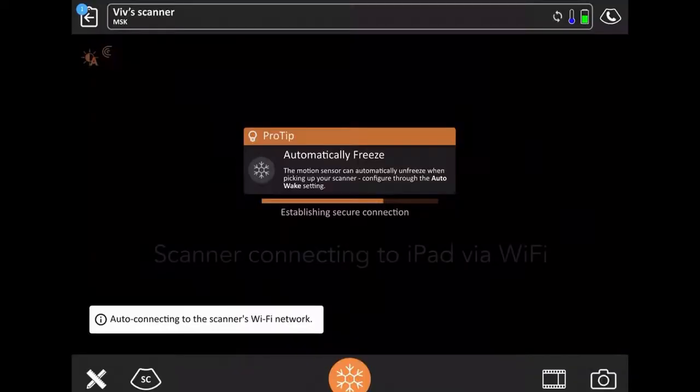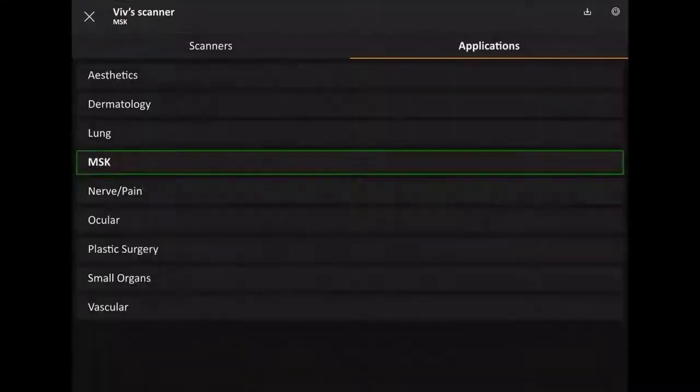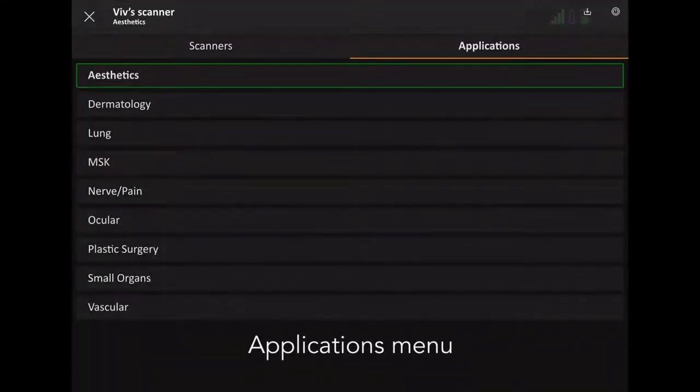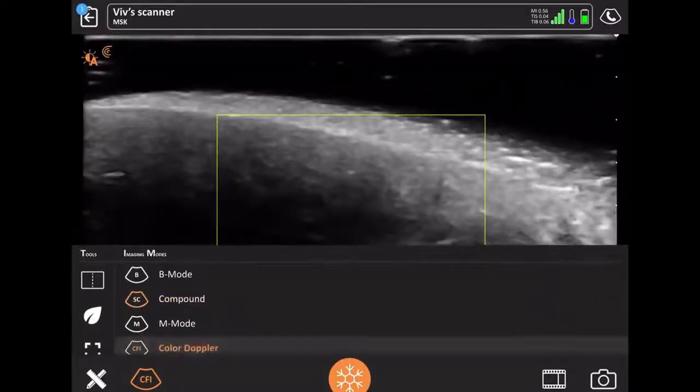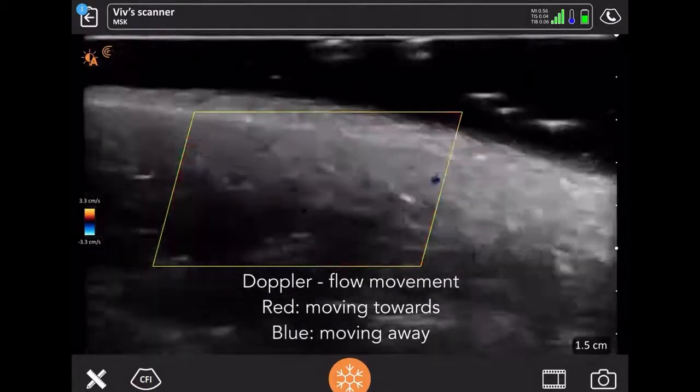Here we go. So this is an intro screen when the Clarius starts up on my iPad. It connects via Wi-Fi, and there's a menu to look at an application. The application is based on the area of the body that's being scanned. So with the facial work, there's aesthetics, there's dermatology, there's a few different options, and those options are to set the scanner to work on that particular area. It sets some defaults up.